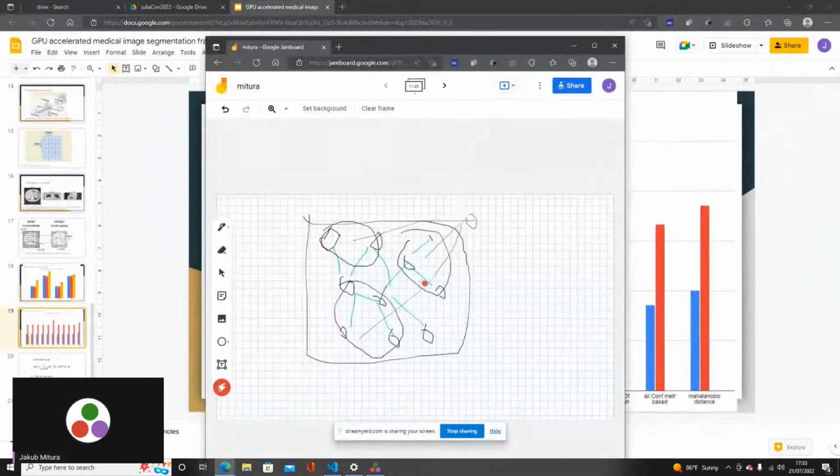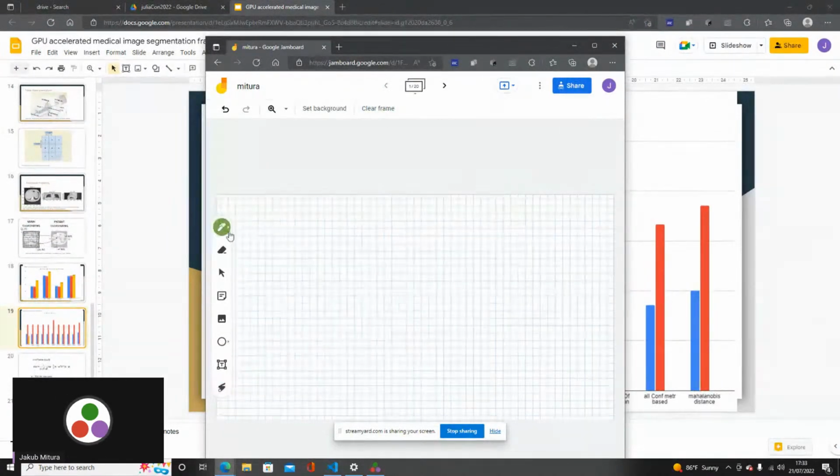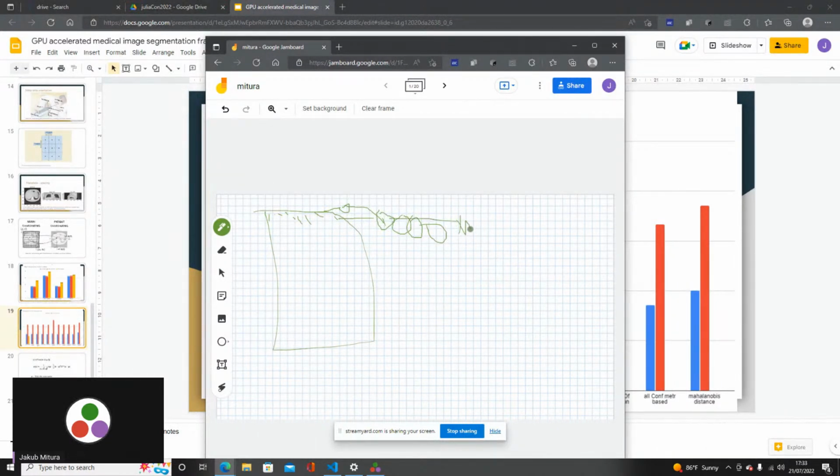What we need to do now is we need to get voxel by voxel, yes, point by point, and there are millions of them, and execute the Gaussian distribution, yes, sample it. Generally, put the argument, so each voxel and some of its neighborhood, into each Gaussian distribution and take the maximum from all of these functions.